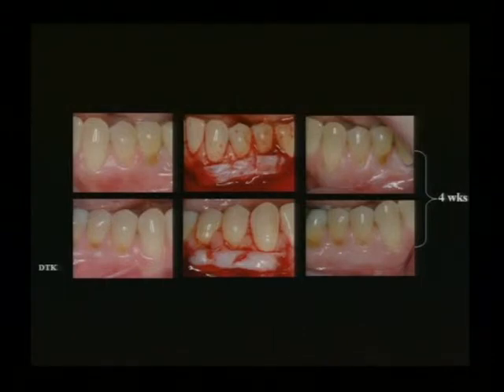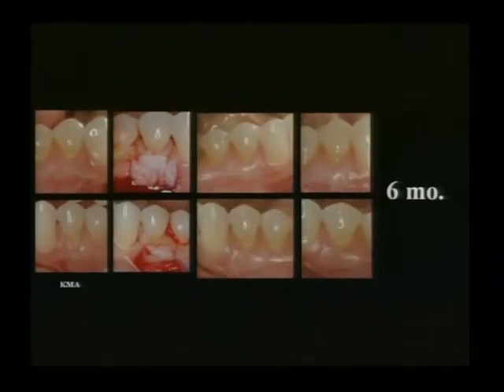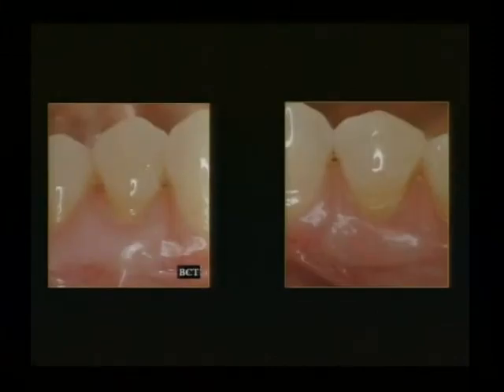As we go out to 6 months in these panels, we've stained it with Schiller's iodine to further differentiate the attached gingiva from the mucosa. And you can see that we have a nice zone of keratinized tissue, and it's resisting muscle pull. Another patient, here is our bilayer cell therapy, our free gingival graft, and if we look at the panels at 6 months, I think you can appreciate how much more natural this looks than this.